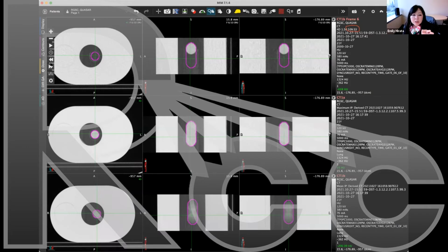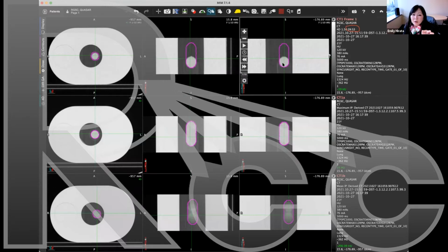I see tumor here, I'm going to fill that in here. I see tumor here, here, here, here. And all I'm doing is taking the largest Hounsfield unit in each of these voxels. And that's why it's all filled in.